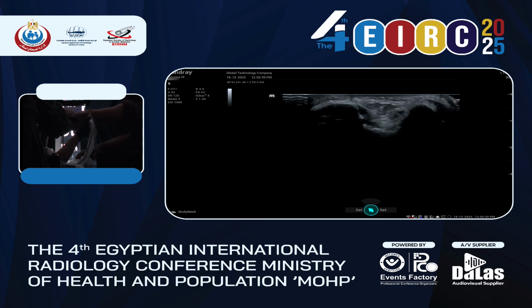Now, sometimes you might feel a little tap. So you might see a structure bumping together with the nerve on top of the medial epicondyle, and this is the medial head of triceps. Sometimes the medial head of triceps has a very low-lying insertion. It goes down, and it subluxates together with the ulnar nerve, or without the ulnar nerve, just the medial head of triceps. And this is called snapping triceps, and it can be a cause of impingement.